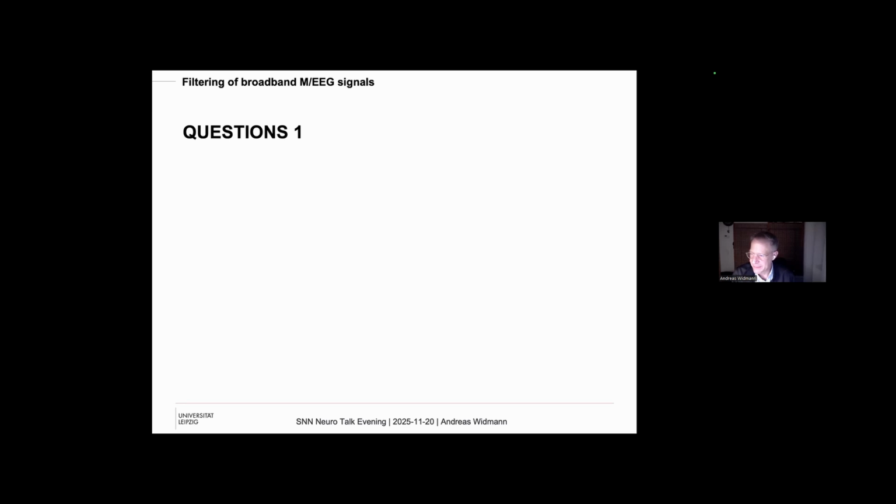I can show that mathematically. It's only a narrow band filter, and then you either do the Hilbert transform or you use the sine and the cosine filter and add them up, basically. So, Regan type. You typically do not need any other filters for steady state responses. It's already a filter, and you look at your signal of interest. You filter out everything else except your carrier frequency and some range around it to capture the amplitude modulation of your carrier frequency.